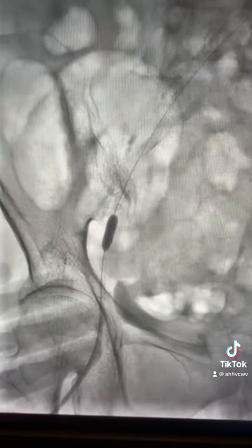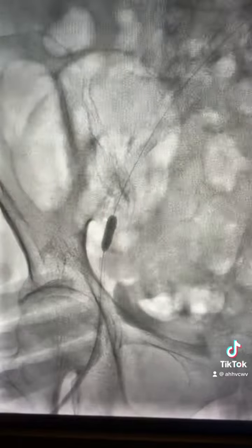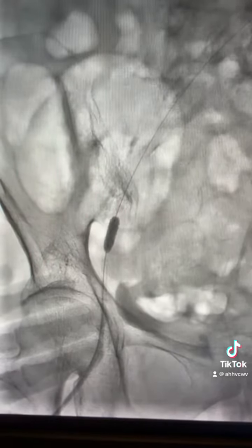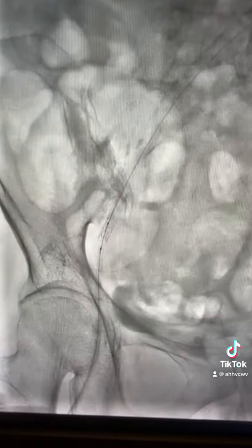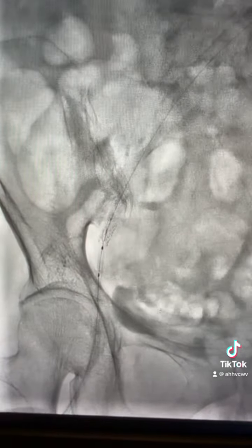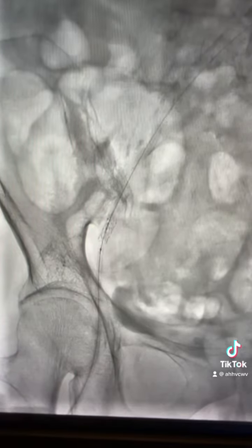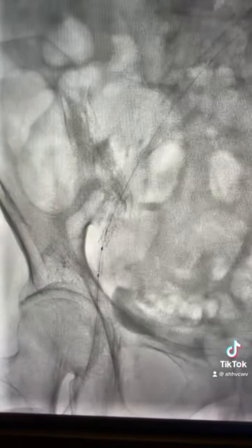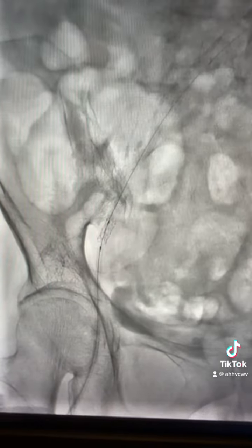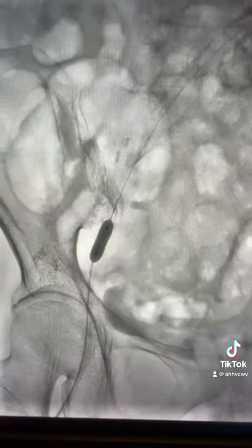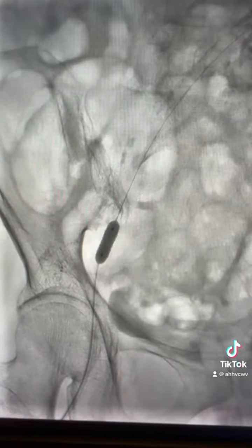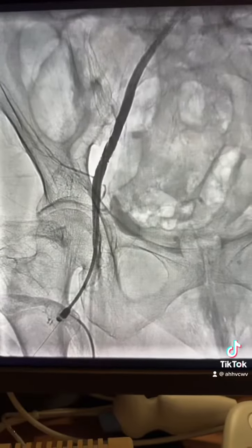Then upgraded to a 5.0 balloon also at high atmosphere, and here the stent was advanced with a 6.0 balloon and inflated at 14 atmospheres. And here is the final result.